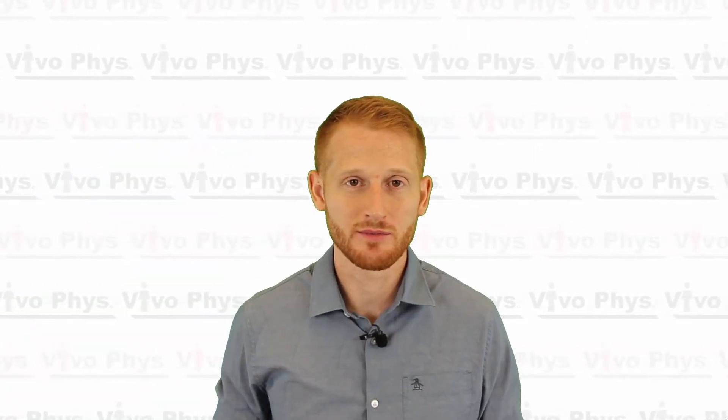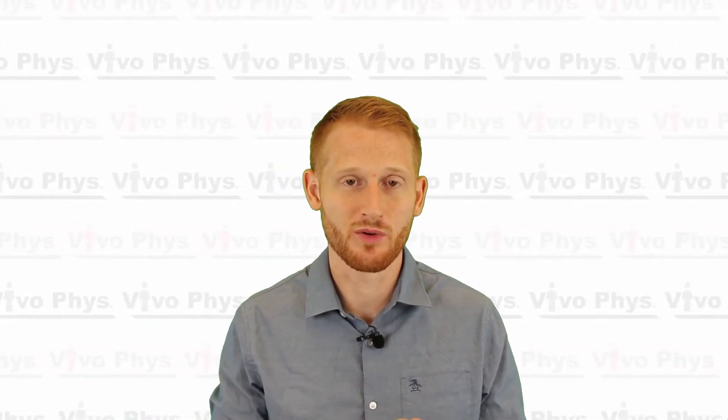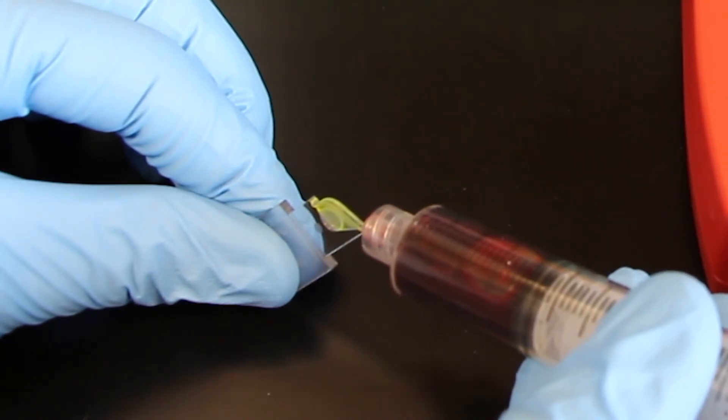Once you have the blood sample, if it's from a syringe you can apply the blood to a micro cuvette designed for the HemaQ device, or use a transfer pipette to take blood from a tube and apply it to the cuvette. There's a little point on one side of the cuvette — load the blood from that tip, like the point of a triangle, so blood flows in using capillary action. This prevents air bubbles inside the micro cuvette, which would artificially lower the hemoglobin measurement.